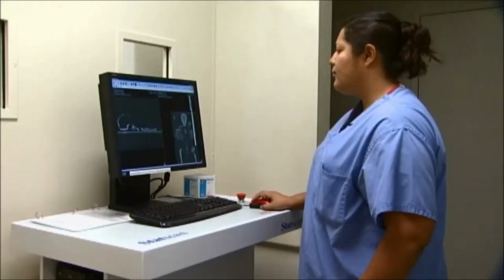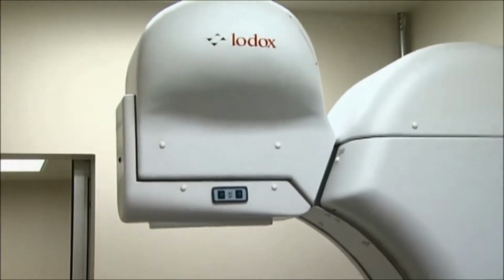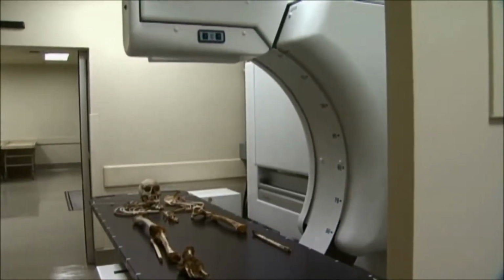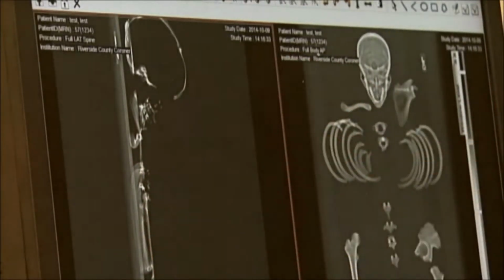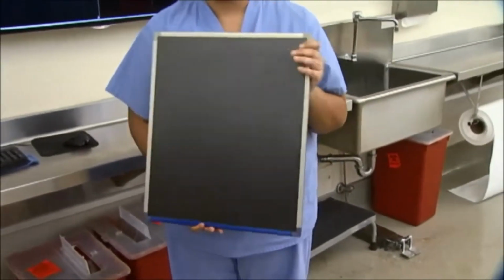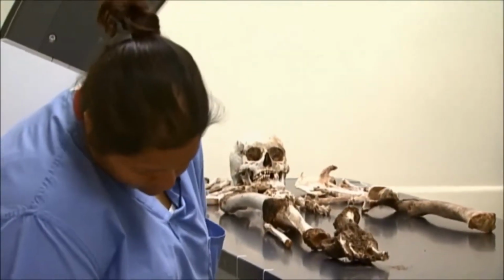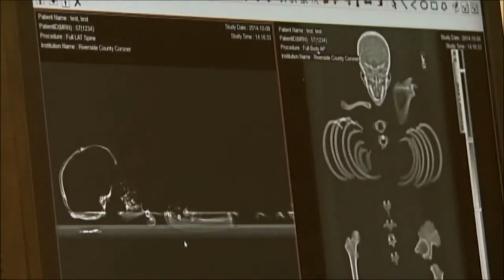The Sheriff's Department just purchased this $482,000 digital full-body X-ray scanner for the coroner's Paris office this summer. It creates a 6-foot high-resolution picture in just 13 seconds while eliminating the need to move bodies to get complete X-ray pictures. That saves both time and money. Light speed ahead. Not only that, the ease of use is great, and the quality of the images are fantastic.